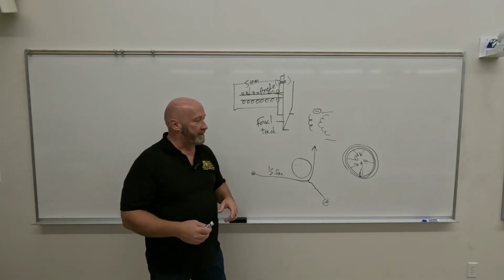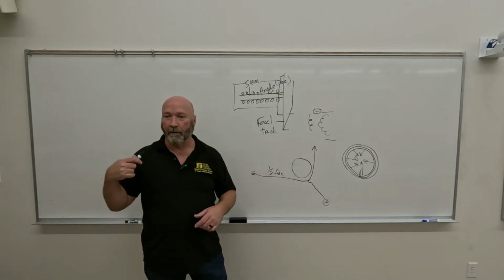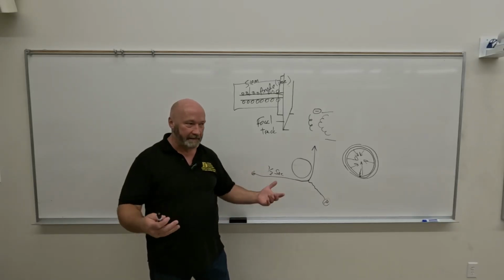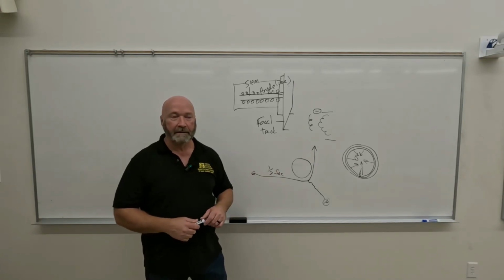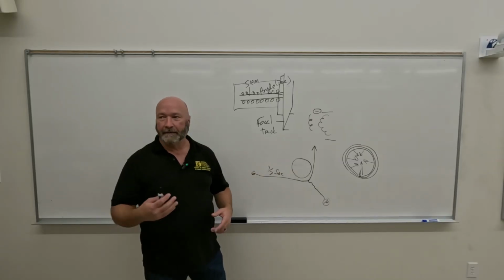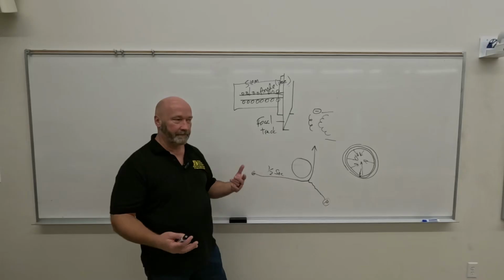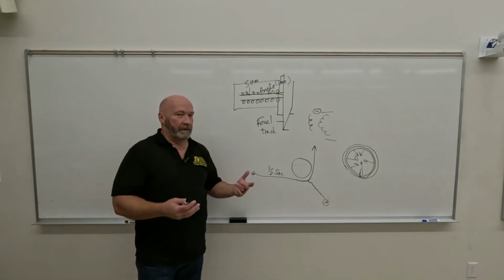So you've got a stationary anode, your tube needs to be replaced. Generally speaking, whenever you start hearing that grinding sound, that's an indication that your tube needs to be replaced. They're expensive though, so sometimes they delay a little bit. You may have to deal with a grinding-sounding tube for a little bit of time.